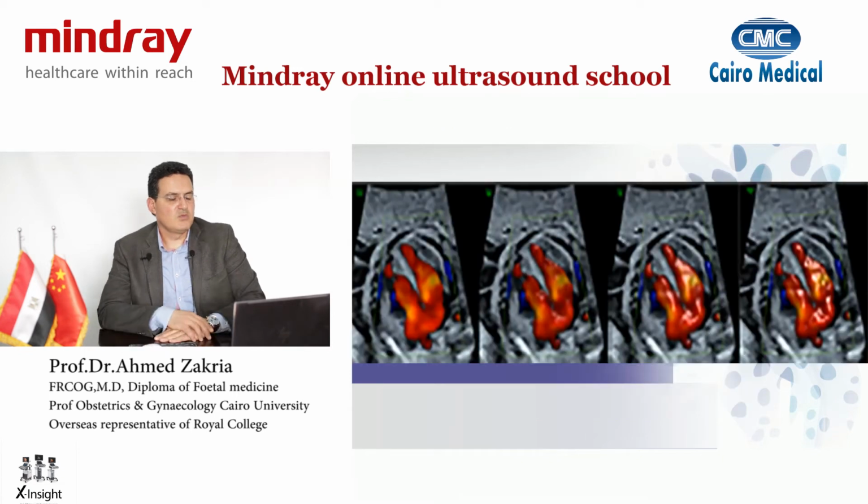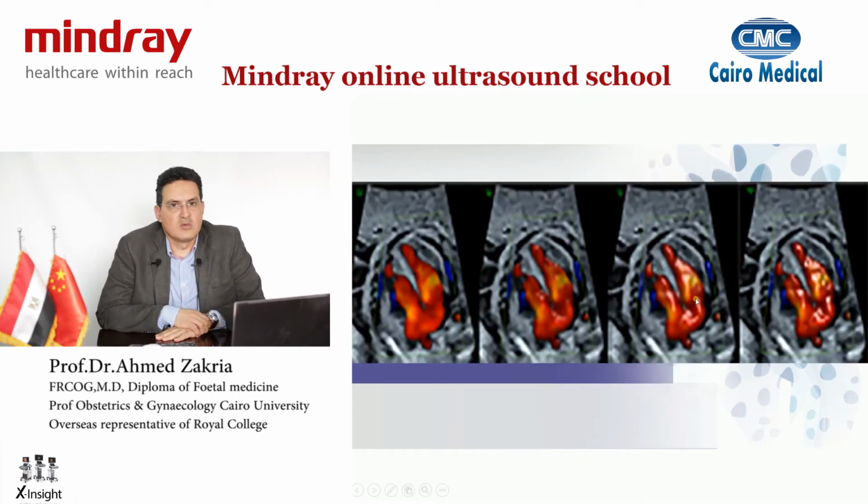You can actually move across different sections of the heart by doing color Dopplers. You can actually see how the different structures of the heart are. Here you can see the pulmonary veins as they go into the atria. You can see the interventricular septum, the blood flow across the heart in a thicker slice, which is actually quite helpful when you want to check for different defects and ventricular septal defects.